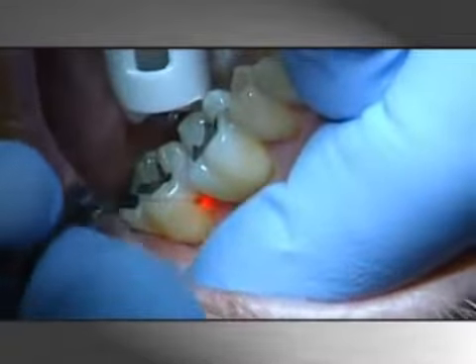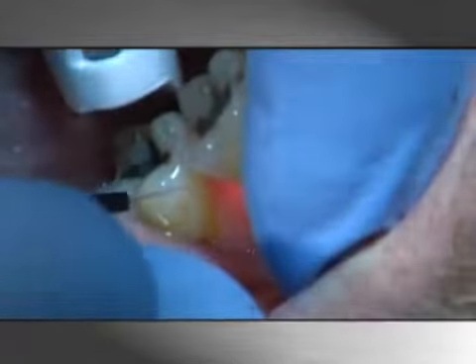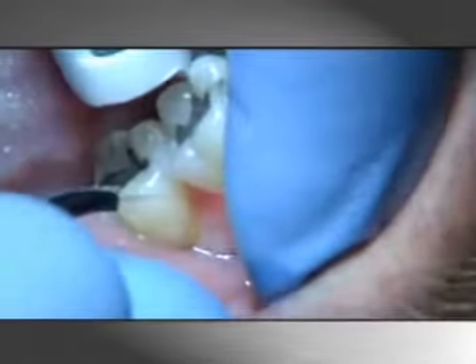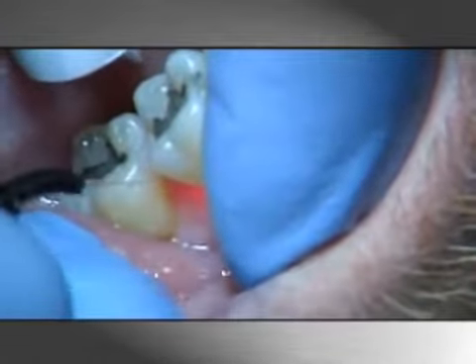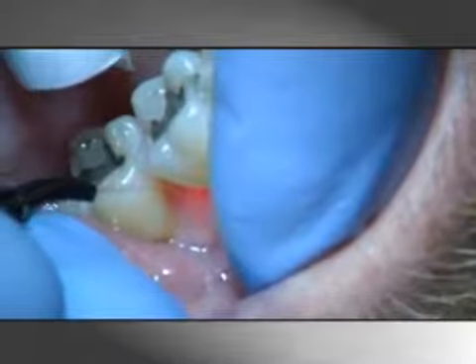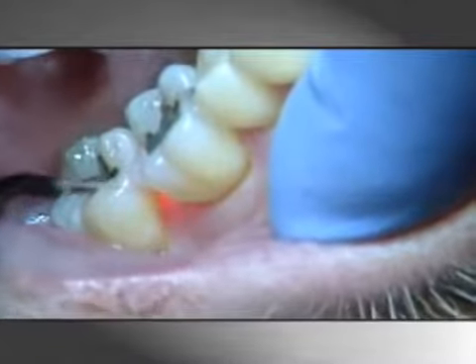The total amount of time for this laser procedure is a function of the extent of the diseased soft tissue. In general, lase pockets 6 mm or less for approximately 30 seconds buccal and 30 seconds lingual, and lase pockets greater than 6 mm for 45 seconds.